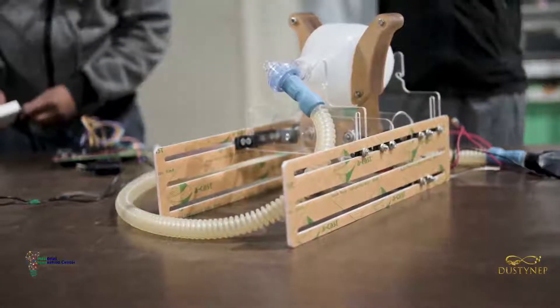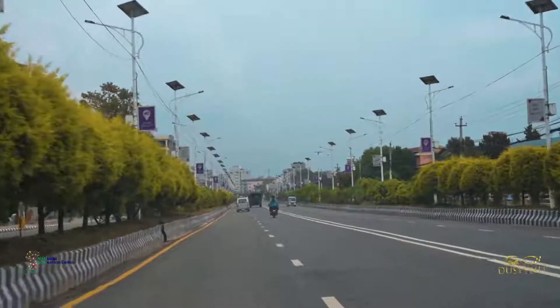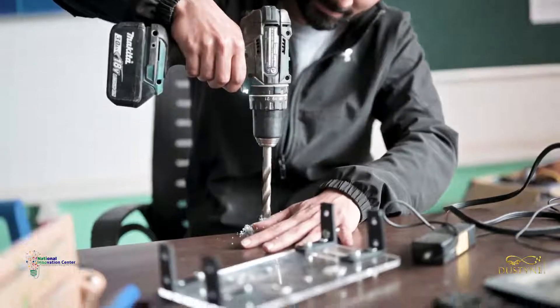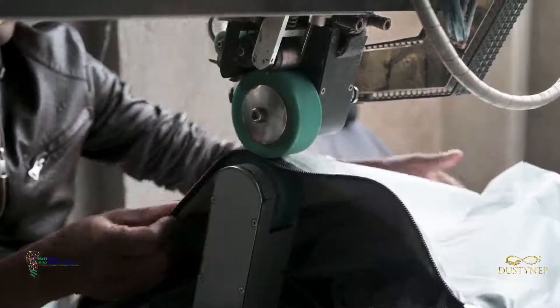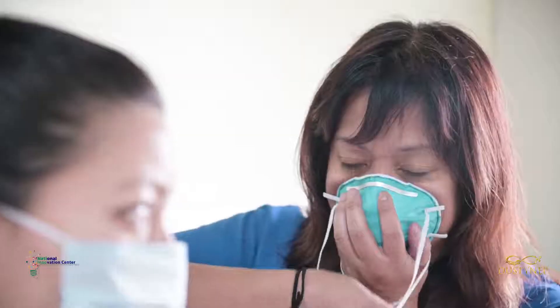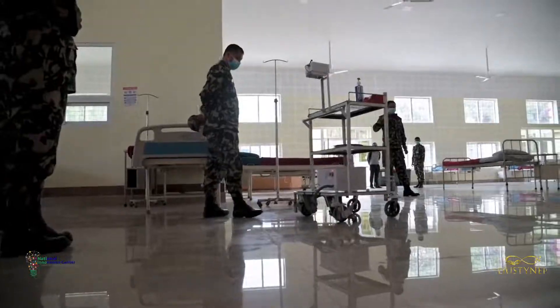The National Innovation Center was able to, during the COVID crisis that is currently going on, use the resources that they had to build several products like UVC disinfectant chambers, masks, PPEs, the mechanical robot, and the ventilators that you can see here.